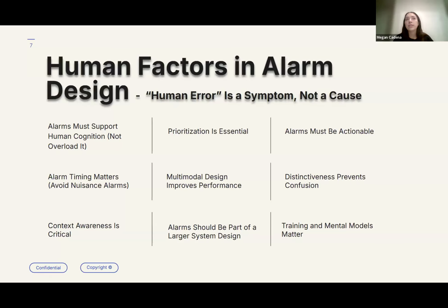So with all the seriousness out of the way, I think it's important to also consider the fun stuff, the creative stuff, and the other attributes that go into design of alarm management systems in medical devices, which would be usability. So usability goes into the intentions of the design for the intended user. And typically this is done outside of R&D, which is my domain, and more in human factors. So I can't go into the details of a formative or summative study and how they aggregate data to better understand the intended user and how they use machines like dialysis or other acute renal devices or other medical devices altogether with alarm management systems.